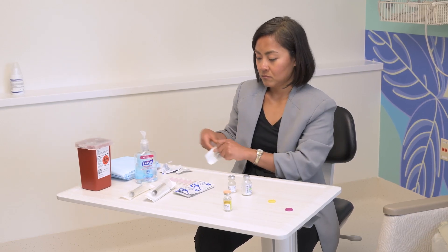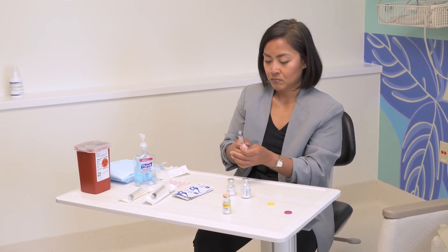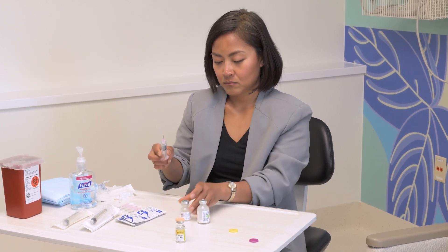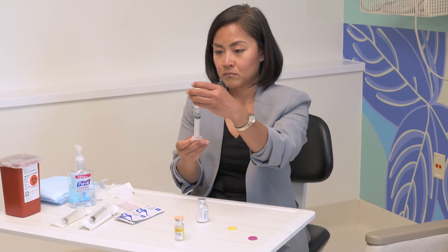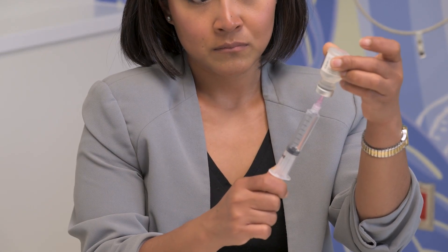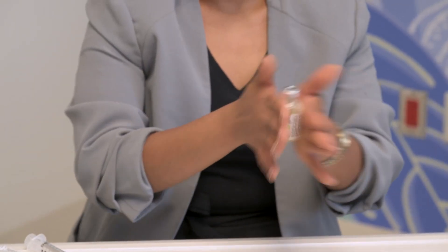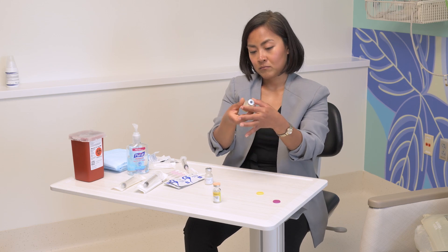Take the empty syringe and add about 5 milliliters of air. Then inject the air into the sterile water vial and draw up 10 milliliters of sterile water into the syringe. Add the water to the powdered antibiotic vial. Gently mix by rolling the vial between your hands or using a swirling motion until it becomes clear.